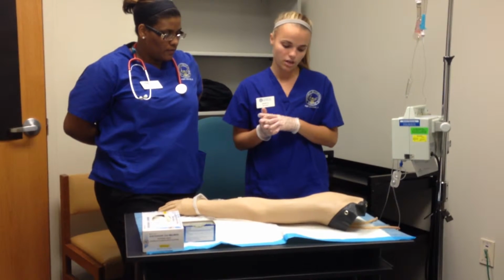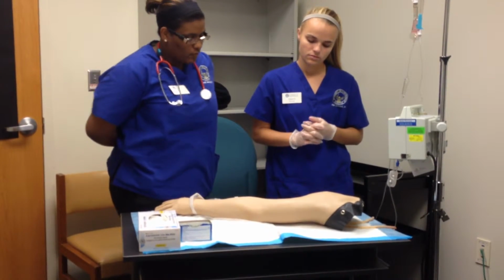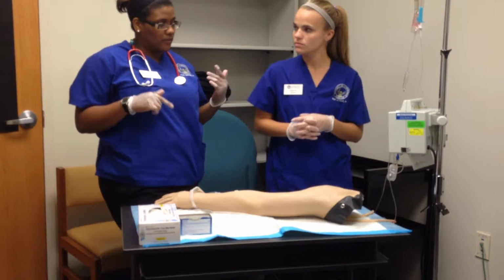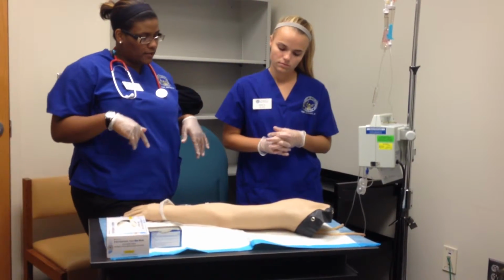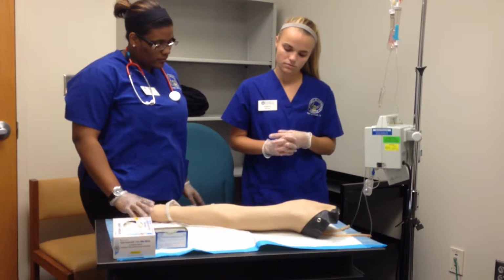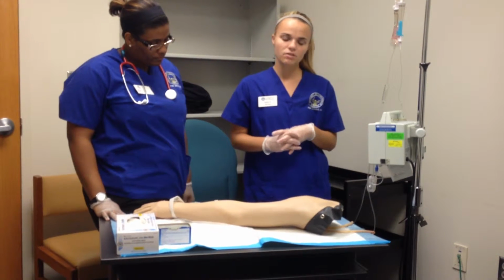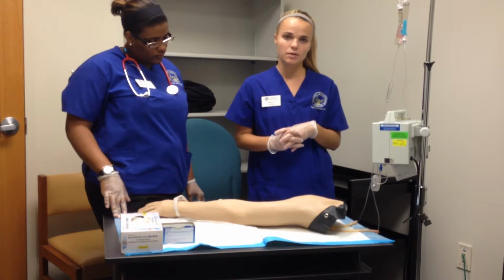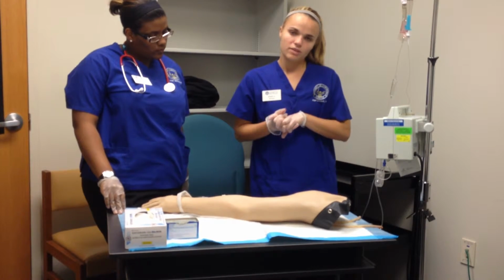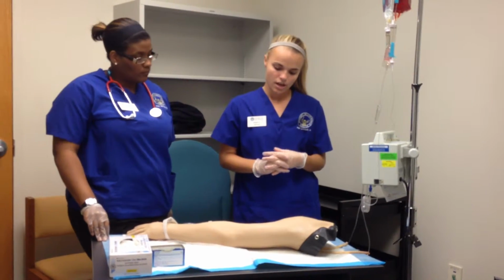of the refrigerator. If there is an acute transfusion reaction, we would stop the transfusion, remove blood and any blood-filled tubing, replace with the saline bag, and notify the blood bank and the provider immediately. Then we recheck tags and numbers and monitor vital signs and urine output, and we treat your symptoms. Also, you always want to save the blood bag and the tubing and send them to the blood bank for examination. Never just discard the blood. You want to save the bag even after you infuse it so that it can be treated as a biohazard. You don't want to just throw it away in the normal trash.